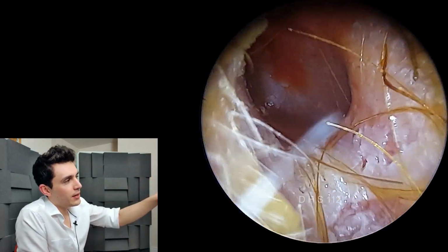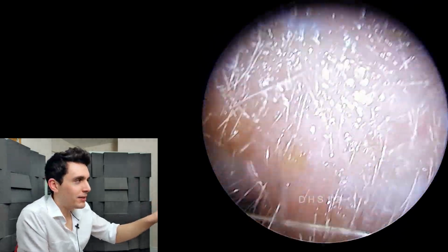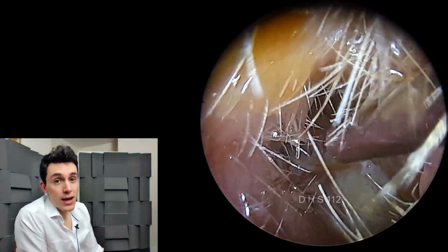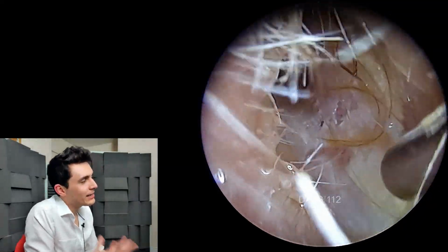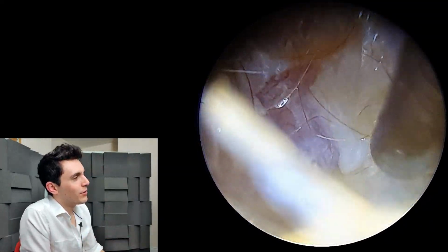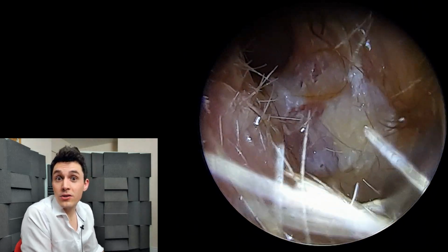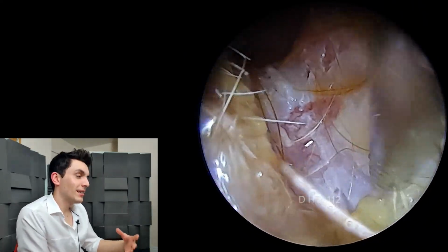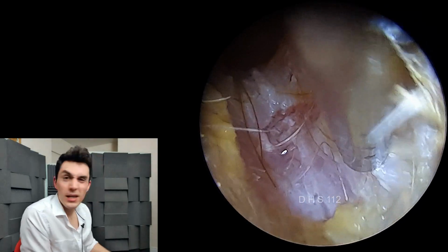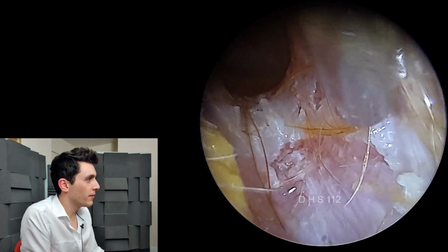So the eardrum there does look inflamed, I have to say, but there's no longer any pain, there's no discharge, there's no obvious swelling. So I wouldn't necessarily say there's inflammation of the eardrum and therefore there's an infection. I would just say that the eardrum looks a little bit erythematic. And that just means red.